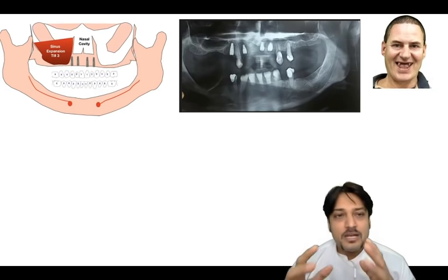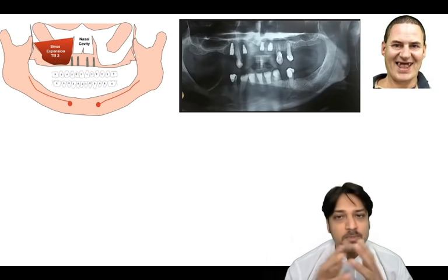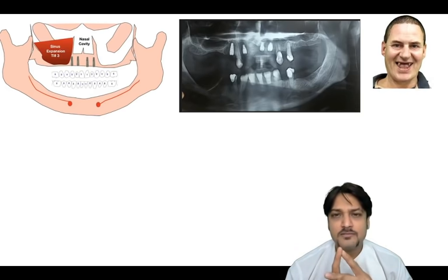Same way, let me show you one case where this patient came to us from UK, and he said that he had received this all on 4, which absolutely was not in a proper alignment. Now there was definitely a sinus expansion in upper and lower jaw.